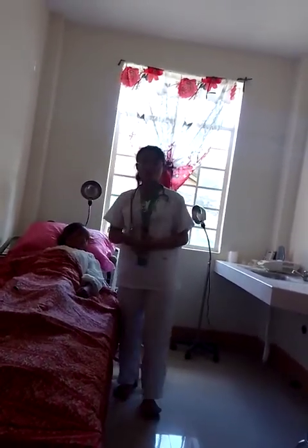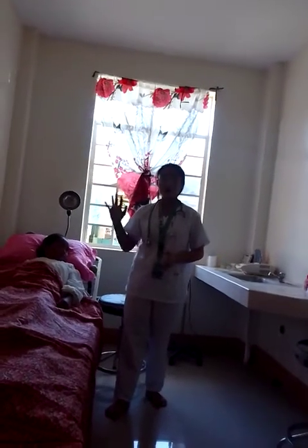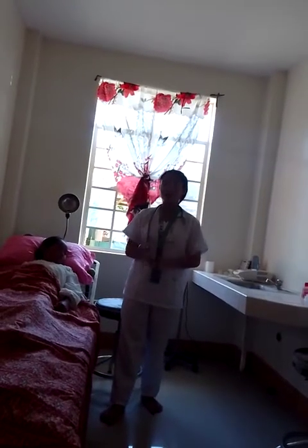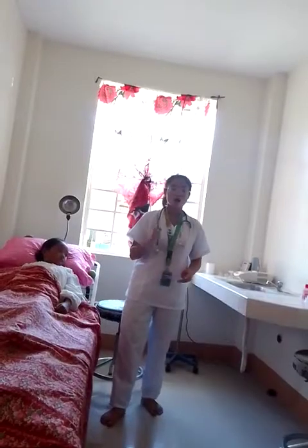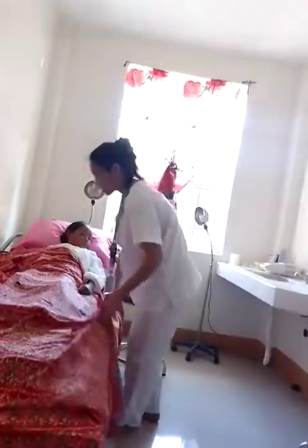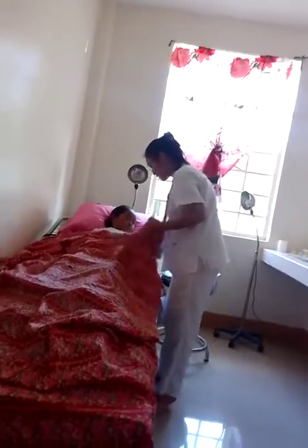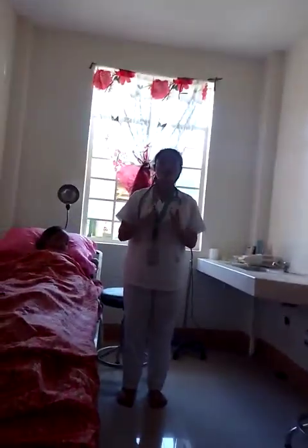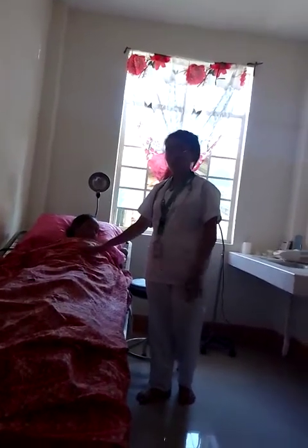So, after that, since the patient is okay, we do aftercare. Not only to the equipment used, but to everything, including the beddings. We need to make sure that things are properly arranged as well as the bed and so on. After that, we need to make sure that the patient is in a comfortable position.